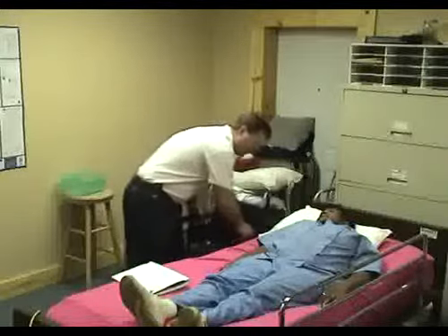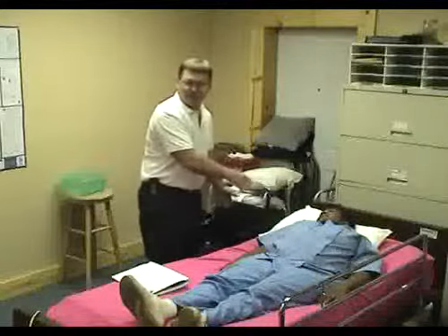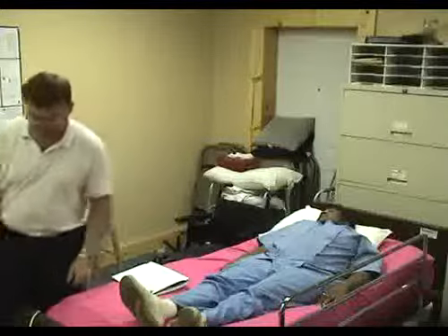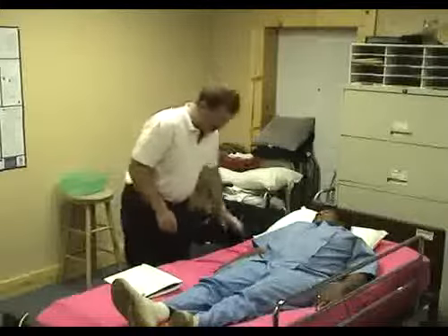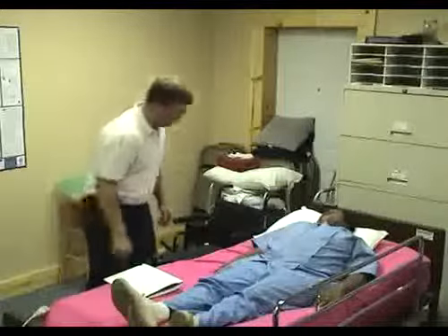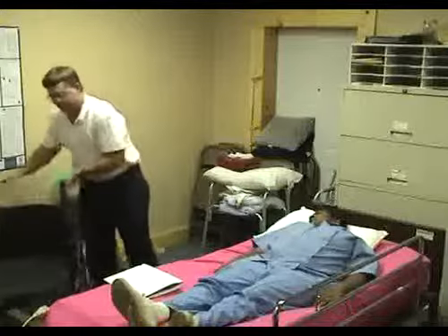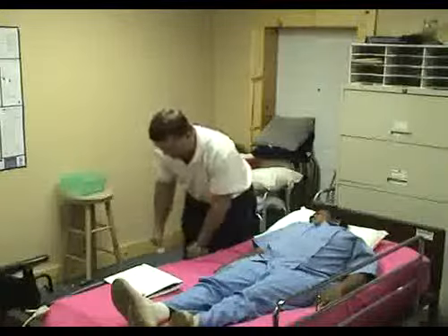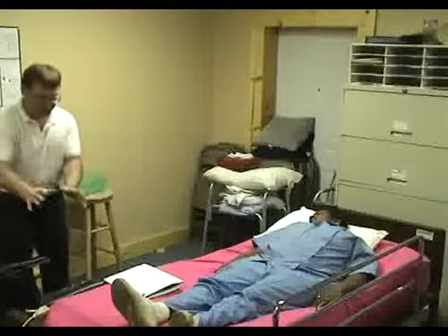The wheelchair, you can either put it this direction, but most of the patients you're going to take care of, they have a bed stand at the top. So you're not going to be able to get this there. What you could do is put the wheelchair there, unlock the bed, pull the bed down to where you can get the wheelchair up high enough to get a 90-degree angle. If not, then you want to turn the wheelchair around the other direction. Put it at the foot of the bed. The problem with this is you have to lift the legs over the wheelchair when you're setting a patient up. So I'd much rather have it at the head. You can do it this way, it's just a little bit harder.